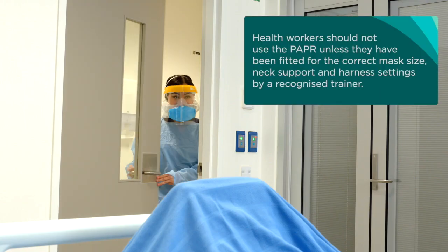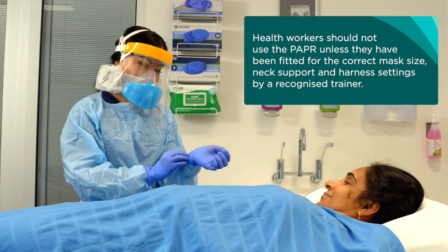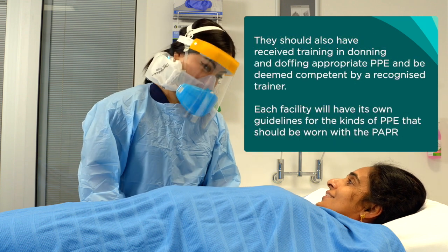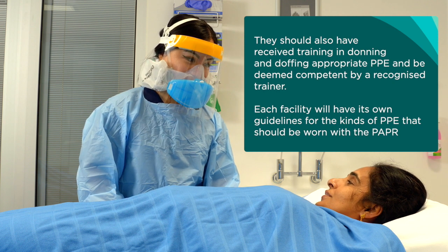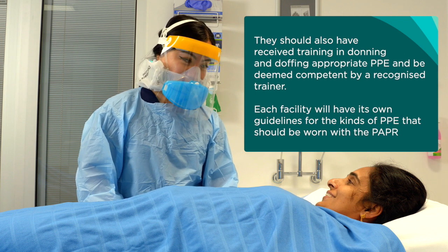Health workers should not use the PAPR unless they have been fitted for the correct mask size, neck support, and harness settings by a recognised trainer. They should also have received training in donning and doffing appropriate PPE and be deemed competent by a recognised trainer. Each facility will have its own guidelines for the kinds of PPE that should be worn with the PAPR.